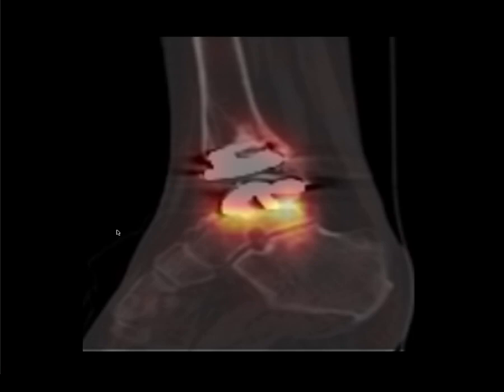Here's that lateral view, and that's demonstrating markedly increased activity around the talar metal bone interface. And indeed, when this patient went to surgery, it was found that this talar component was loose, and it was removed and replaced.